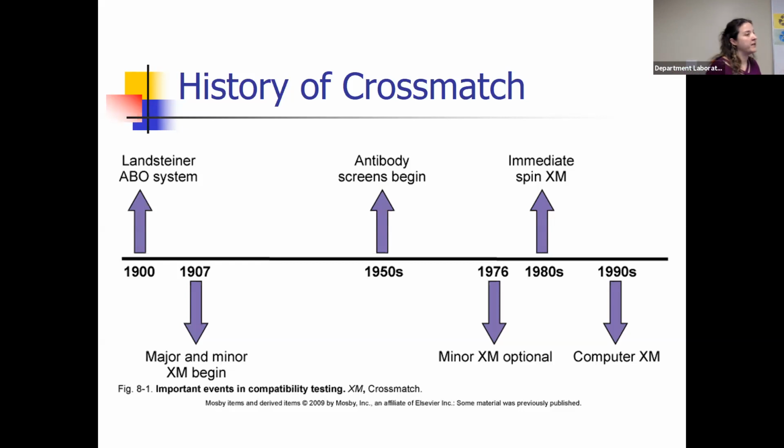You have to have a validated lab management system, blood bank management system in order to do an electronic crossmatch. Okay.